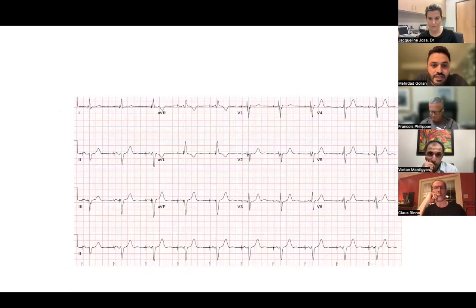This is more of a septal kind of capture. And at this point, again, I was debating, do I push it in a little bit more, or don't push it in a little bit more? It feels like you need one more screw, but then I always get worried about puncturing through, especially in a normal septum. And I can't remember if I put in the septogram on this one or not. It might be the next slide.